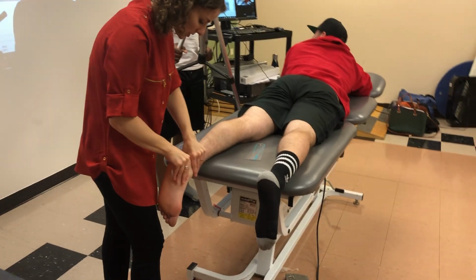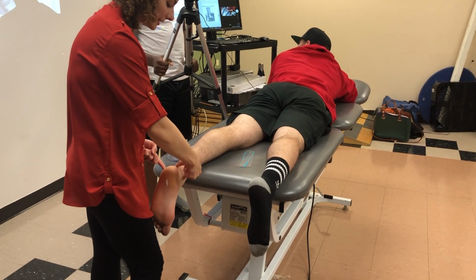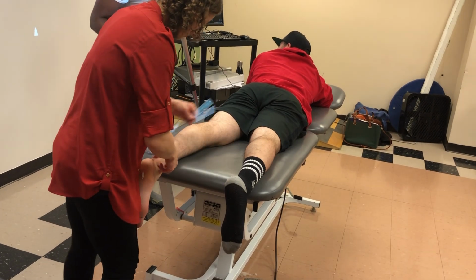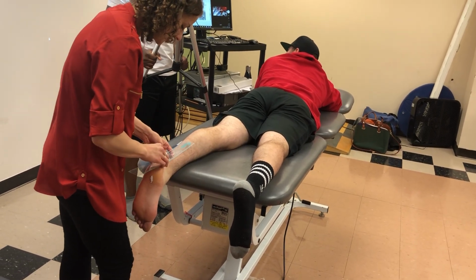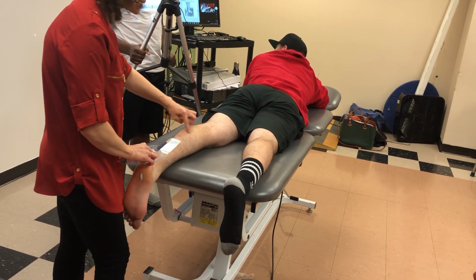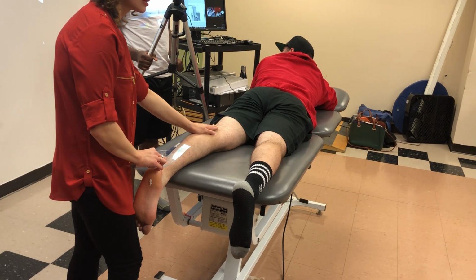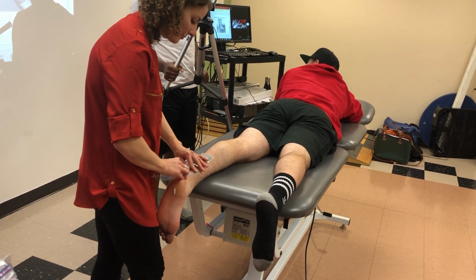Okay, so to measure this one, again, we go midline between the medial and lateral malleolus. And you're just going to try to line up the stable arm with the midline of the calf. So there's no bony landmark up here to reference, it's just the midline of the calf.